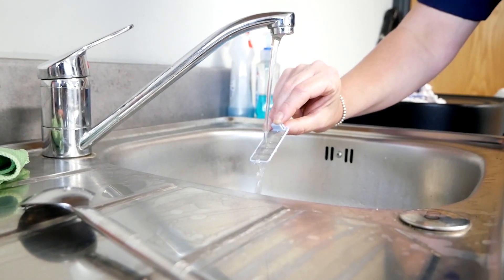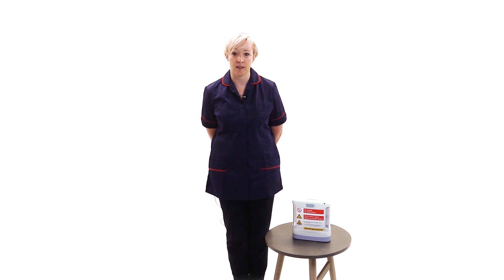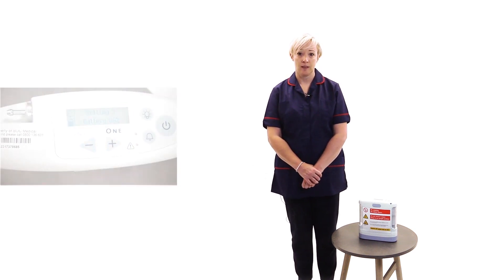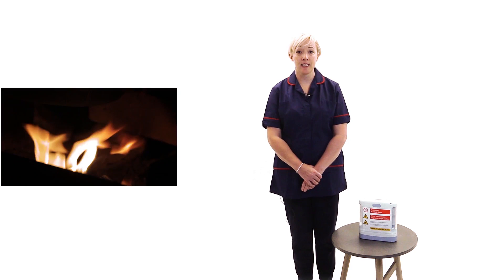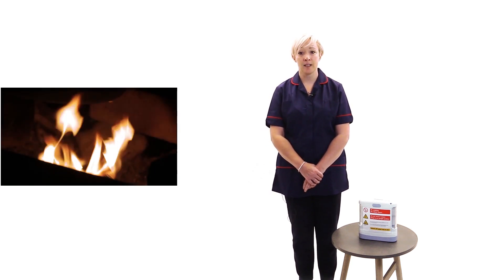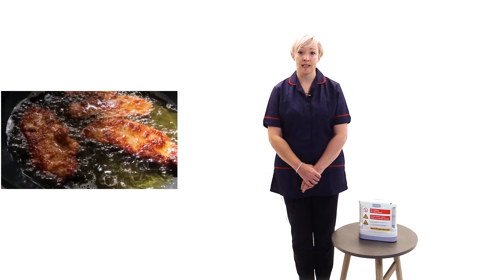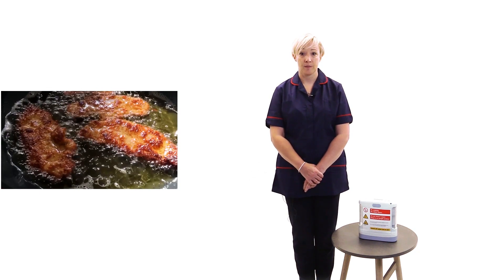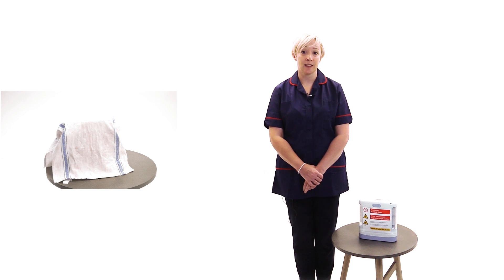I am now going to cover some safety points. This list is not exhaustive so it is important that you are familiar with the safety advice provided by your home oxygen service provider. Make sure that you do not adjust your prescribed flow settings unless instructed to do so by your healthcare professional. Keep the concentrator upright. Make sure that the concentrator is at least 10 feet or 3 meters away from naked flames such as open fires, gas fires and cookers, and at least 5 feet, which is about 1.5 meters, away from other heat sources or electrical appliances. Do not use oil or grease and make sure that your hands are clean and dry before using your device. Do not cover the device with clothing or any other material and ensure that the air intake filters and exhausts are not blocked.